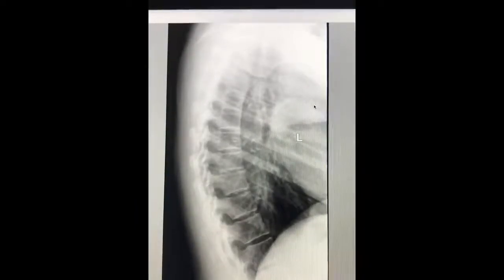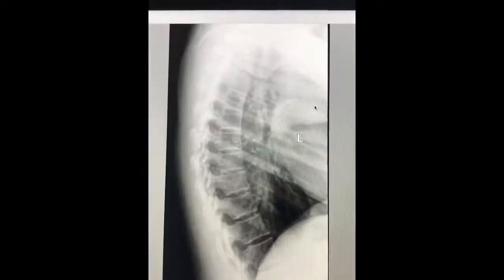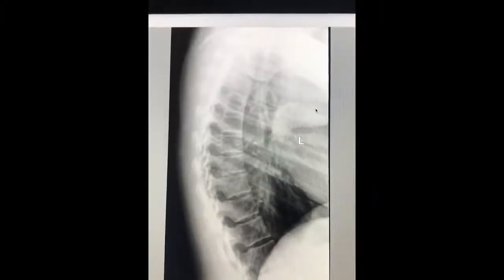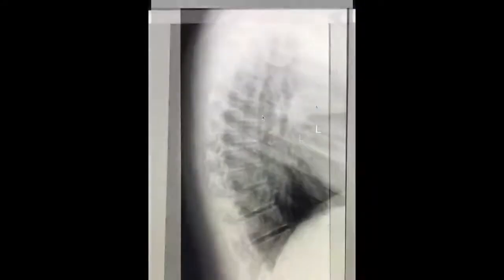You must have a lead marker, you must collimate sufficiently, you must have your patient identification, that's your patient name, surname, your patient identification number, the date and time of the examination. Also include your dose or your exposure index, and then remember to check for any artifacts on your x-ray.